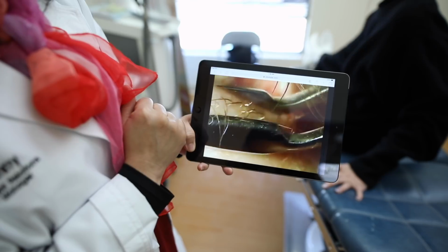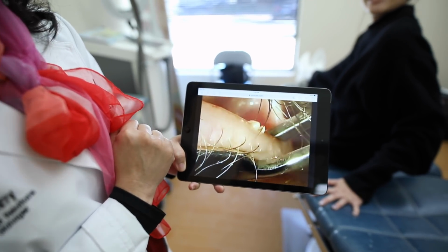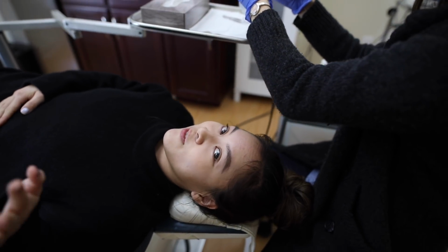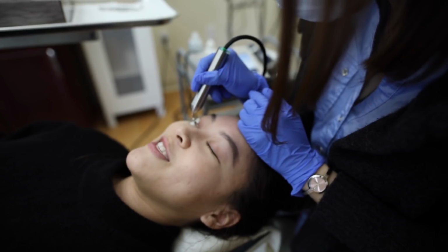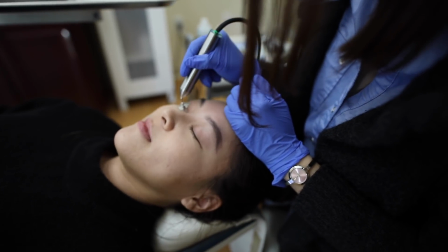She's putting the clamp between my eyelids and squeezing out like a pimple. See that? Yeah. So I'm gonna be crying. I wasn't nervous for the Lasik part, but I am for this. It feels kind of good. It's like rubbing my eyes. The first step.